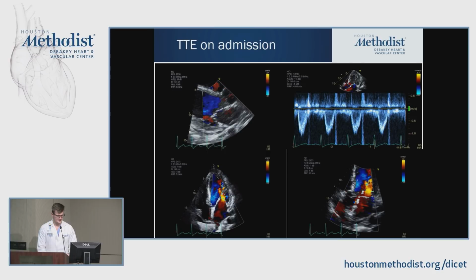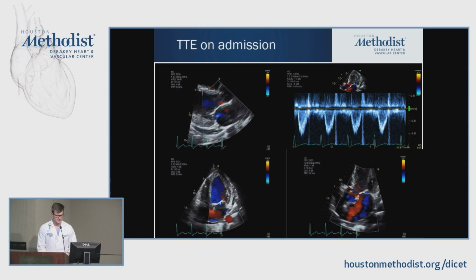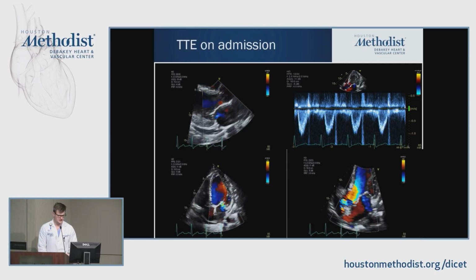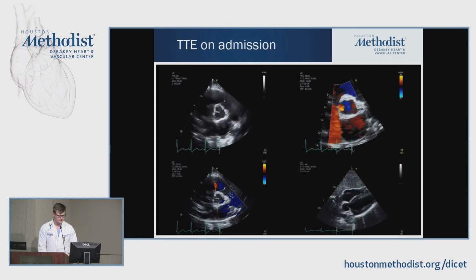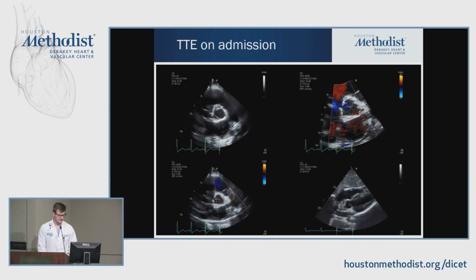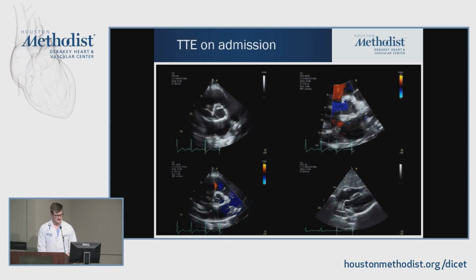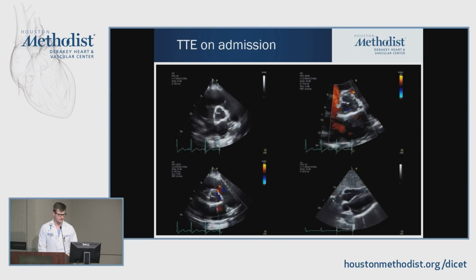And walking through the valves and valve function, obviously looking for some masses or vegetation as a reason for those consolidations in the lungs. The mitral valve is overall normal looking, not really thickened. There is only mild mitral regurgitation. The LVOT flow is preserved with that TVI. Pulmonic valve looks normal. Aortic valve on the short axis, overall not thickened, no suspicious masses seen, and tricuspid valve is also not thickened, overall normal looking valve. So besides the mildly abnormal ejection fraction, this echo didn't really raise any suspicion or concerns.